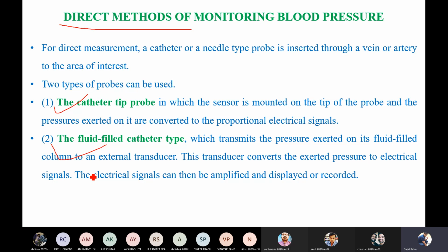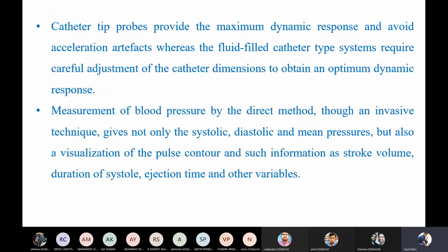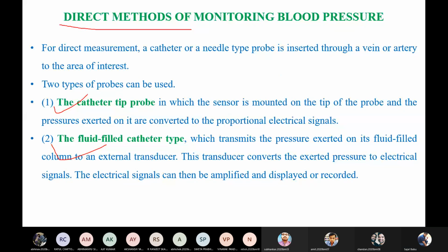What the transducer will do is convert the force exerted on the fluid, the exerted pressure, into an electric signal. You are going to amplify this signal and display it on a display, or you may record it. This is how both types of catheter probes are going to work.